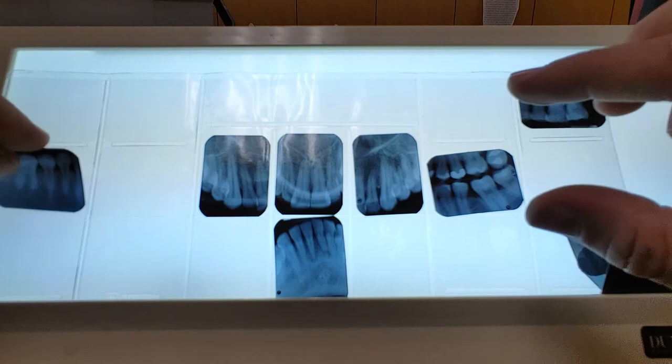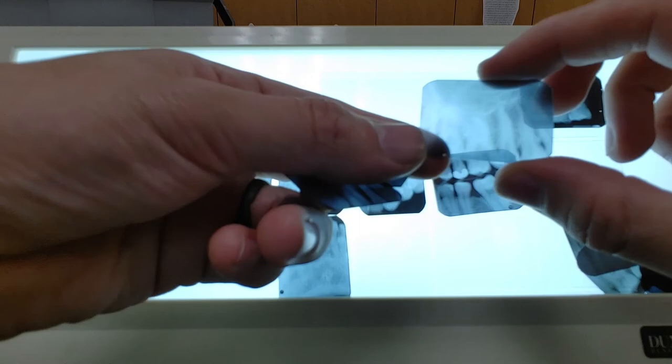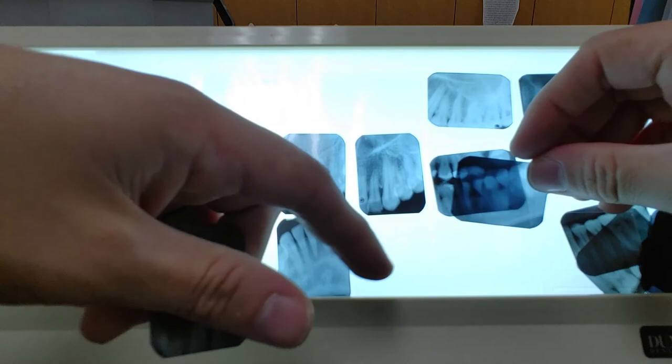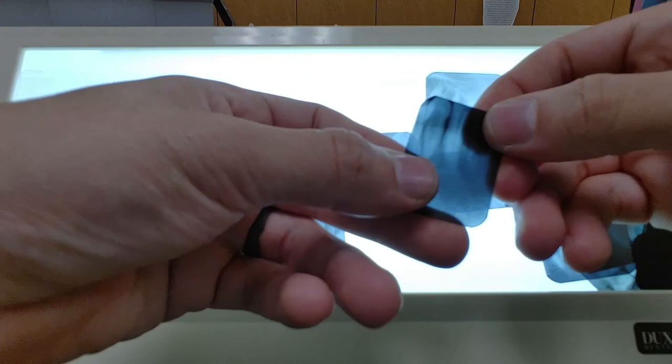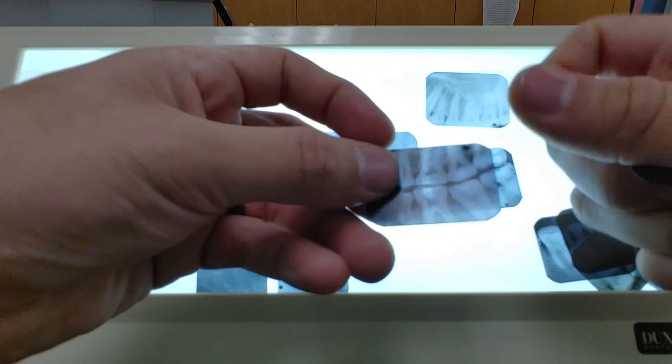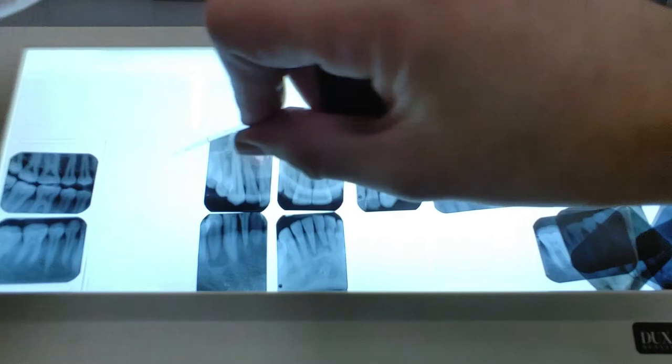This next one is shirts and pants — two roots — so I place it on the bottom. The order is molar, molar, premolar, premolar, then probably canine. Continuing: next X-ray had a dimple, flip it for the pimple side — this goes on top, I see the maxillary sinus. Next: dimple flipped to pimple — this is the lower left molar. Another: dimple to pimple — looks like a wide canine but with small incisal edges. Keep going from there, and for those bite wings that could be premolar or molar, you can reposition them at the end once everything is in place.